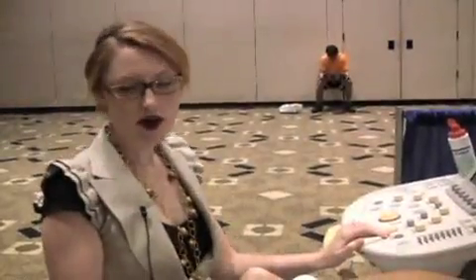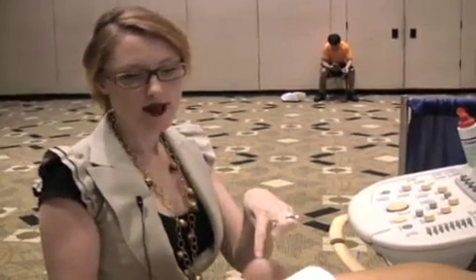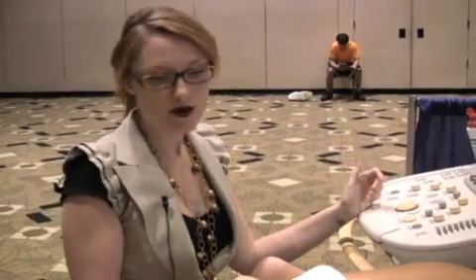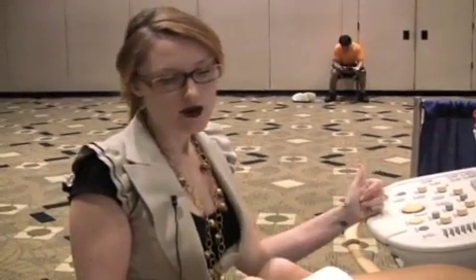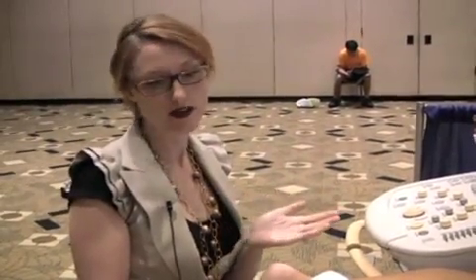So this is a modified foot and ankle ultrasound. The foot and ankle complex is incredibly complex, and people need to really be guided by patient symptoms. I don't want to go ahead and cover everything in foot and ankle. I need everyone to be aware of the fact that there are so many structures that are possibly affected.